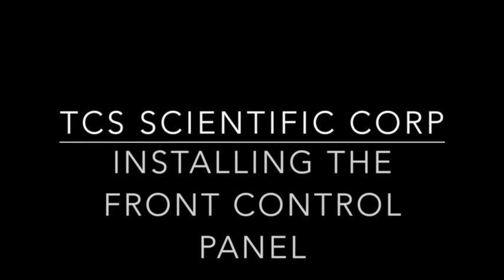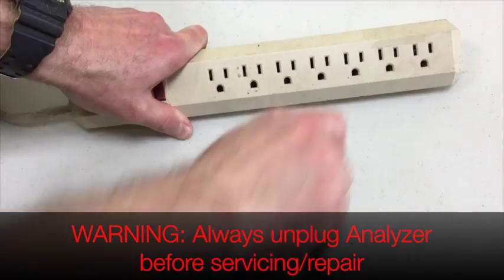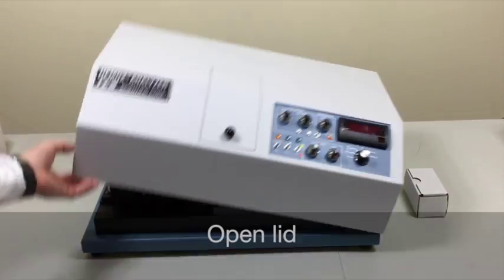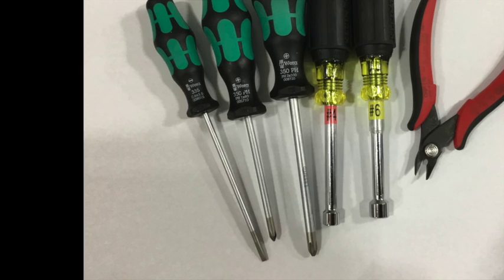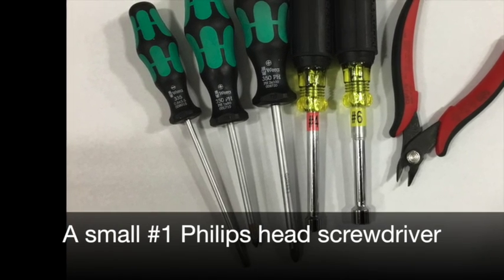Installing the front control panel. Before working on your HEMOX analyzer, always make sure that you unplug it before servicing or repairing. Open the lid.